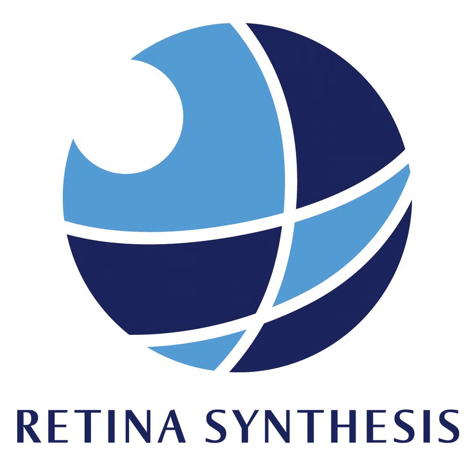I don't think it's going to be banished from the face of the planet, but it's not cost effective. It's hard to do, relatively speaking, especially at satellites. And so I think it's kind of more of a secondary resort. Certainly as a first-time exam for a new patient coming in, one FA at baseline, I don't think hurts just to get an evaluation of the overall disease. But after that, you're not following patients with FA anymore these days.